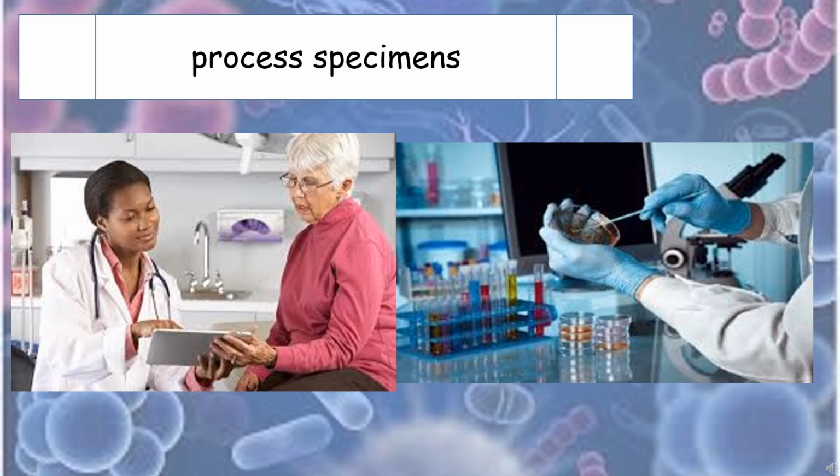To advise the physician as well as process specimens, which is the process of preparing biological samples for analysis. It involves obtaining the sample, treating it, and then analyzing it.